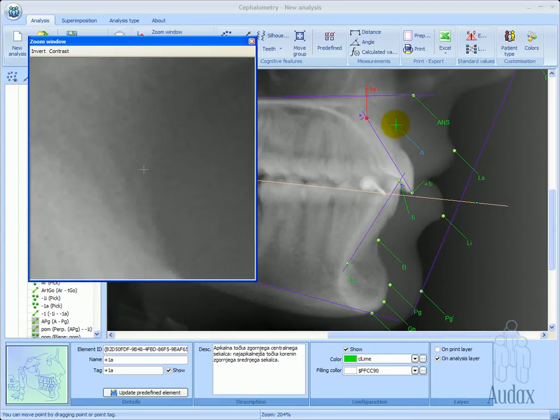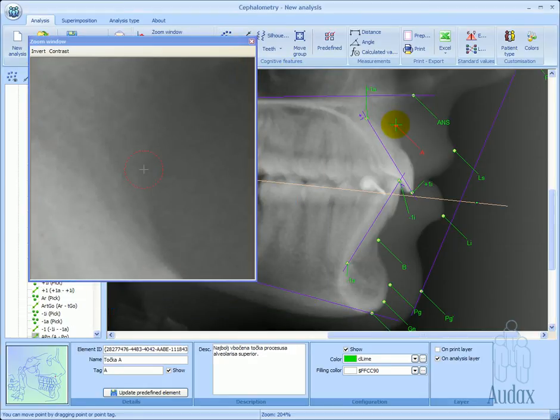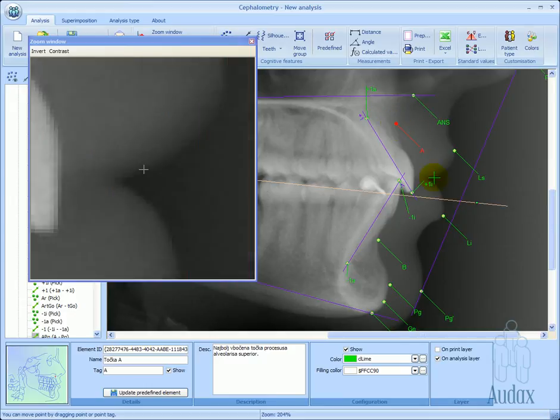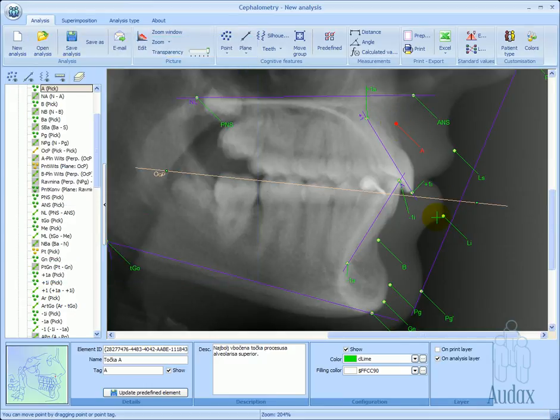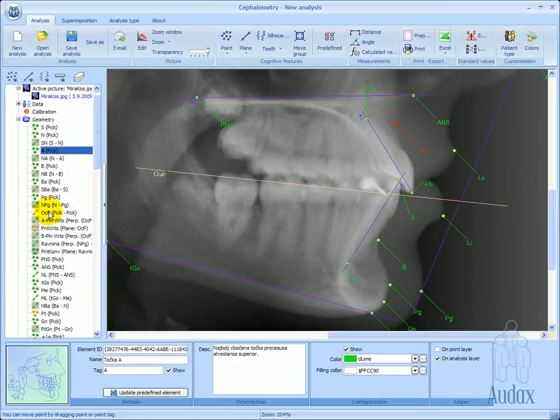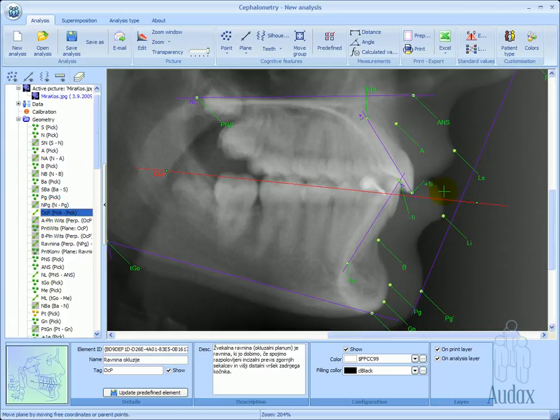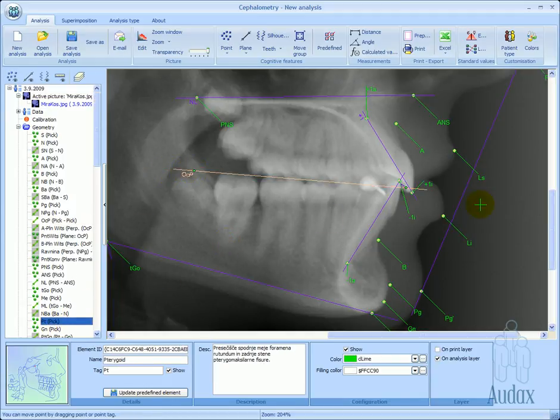We can adjust the position of a single point at any time and then check the location using the magnifier tool. At this stage, we need to be sure all the elements have been positioned. In the structure tree, all elements that still need adjusting are marked yellow. When we select such an element, it is highlighted in red on the x-ray image.